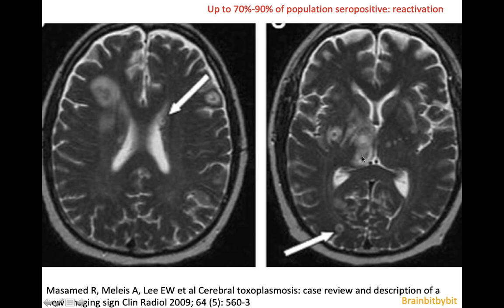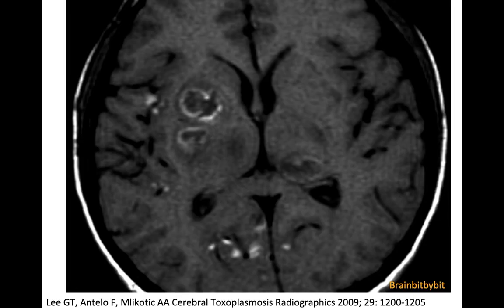The target lesions are T2 hypointense with a rim of edema, and the edema seems disproportional to the size of the inner circle. On post-contrast images, there is rim enhancement with a central nodule that also enhances.